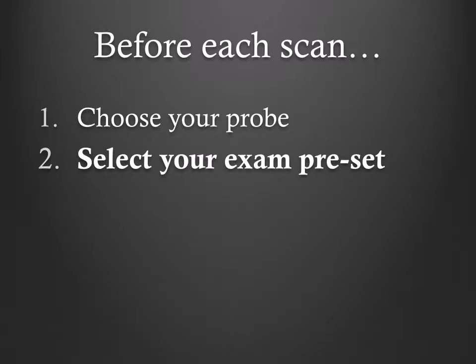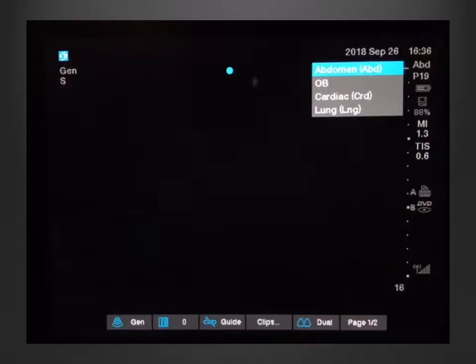Second, select your exam preset. You will choose your preset according to the area you are scanning, which makes subtle changes to the image to optimize your exam. As a warning, the lung ultrasound preset is great for the pleura and lung parenchyma, but the abdominal preset is the best for pleural effusions.